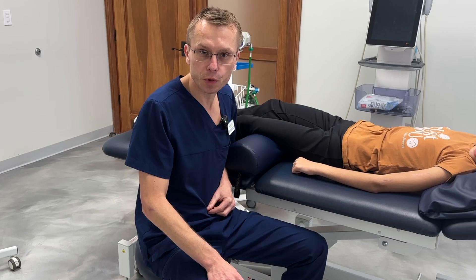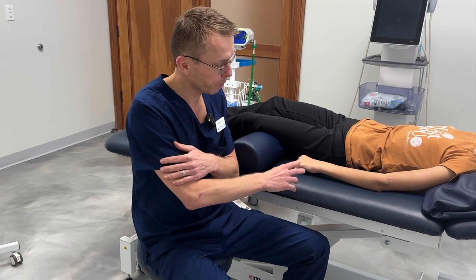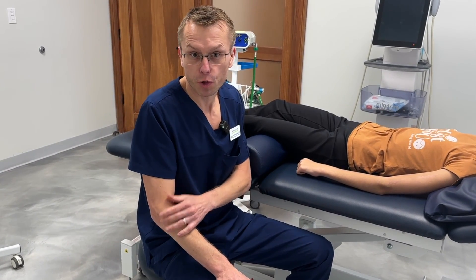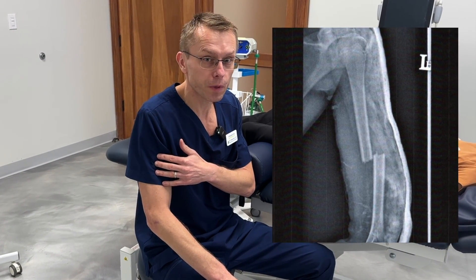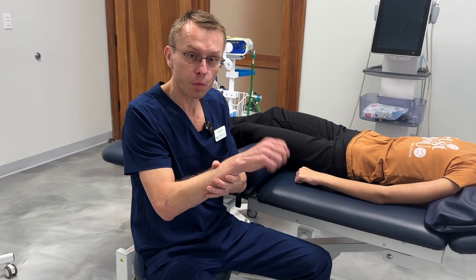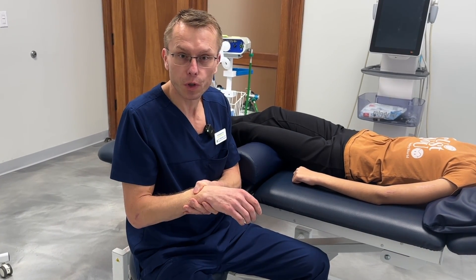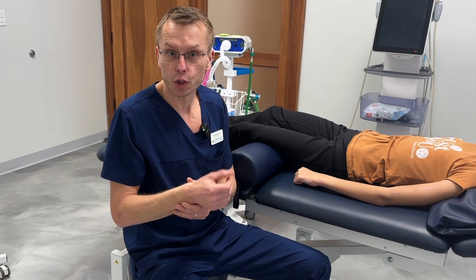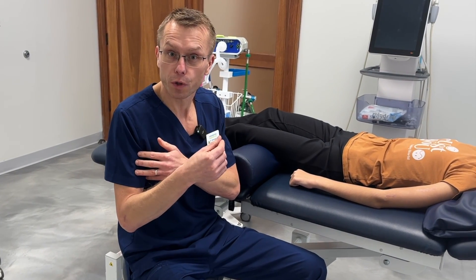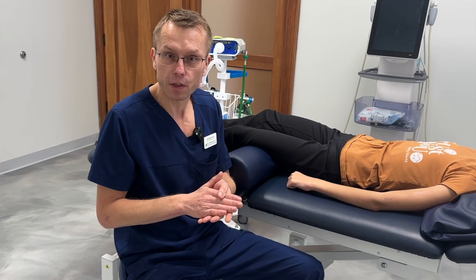Hi, today I'm going to show you how I'm going to treat a radial nerve injury. This girl had an injury of her radial nerve after a fracture that happened about three months ago. She's unable to move her wrist, so what we're going to do, we're going to take some PRP — we already collected some of her blood — and we're going to inject it around the radial nerve and into the radial nerve, and hopefully give her some function back.